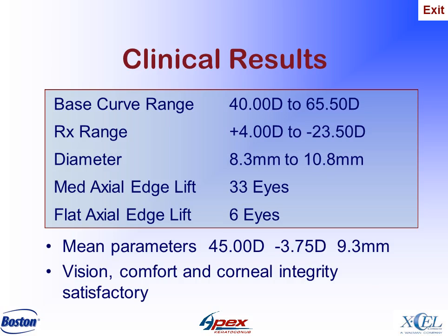Only 5 of the 39 eyes required a change in parameters following the dispensing of the original lens. Of these 5 eyes, only 2 required a change to different gas-permeable lens designs. All the remaining patients fitted with the Apex design completed 6 months of follow-up care, and at the end of the evaluation, vision, lens comfort, and corneal integrity were all satisfactory.